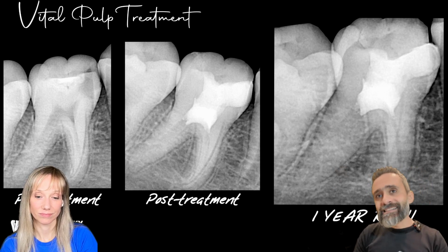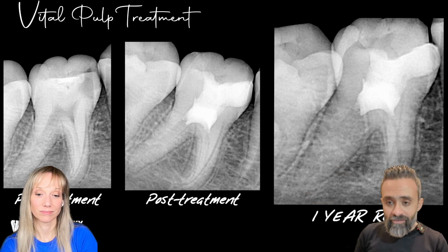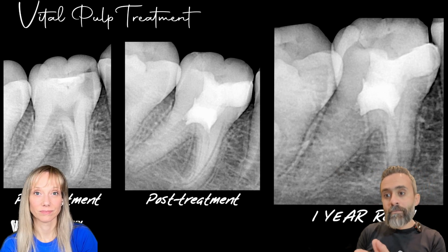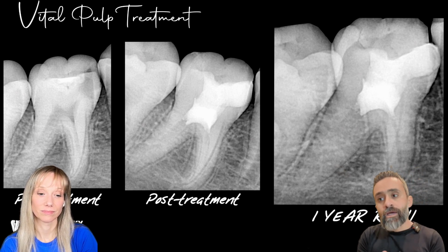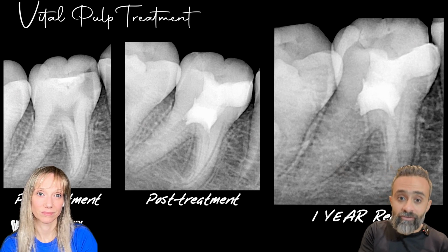We can say that it is a delayed failure of the procedure, not because of the procedure itself, but because of the coronal seal. So more than just taking an X-ray and making sure that the patient is functioning well, is to examine periodically the integrity of the restoration.